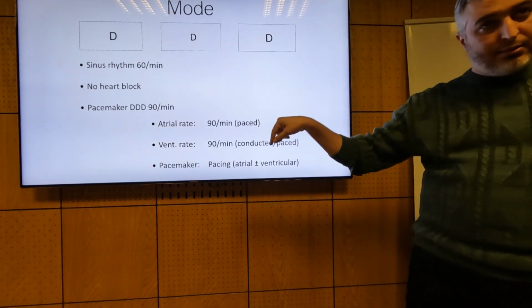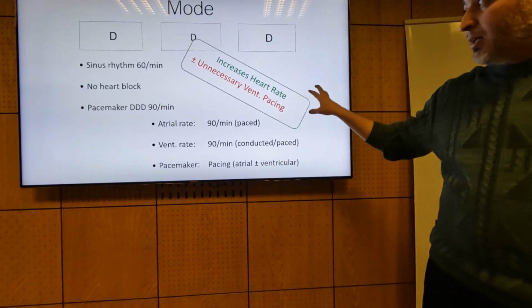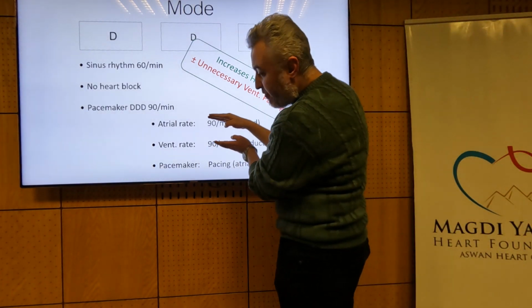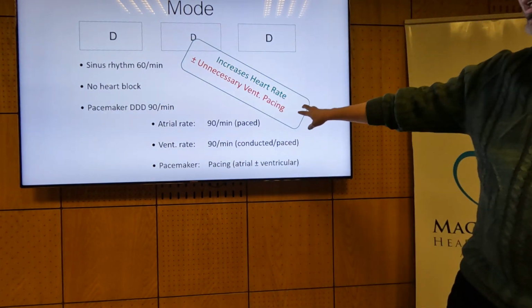We have increased heart rate, but with unnecessary ventricular pacing. We've always been following the AV association. Okay? But you can pace ventricular unnecessarily.